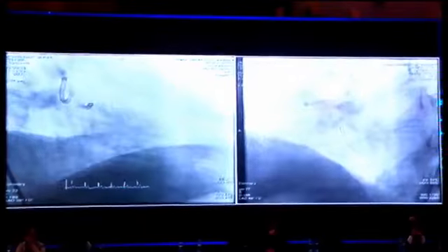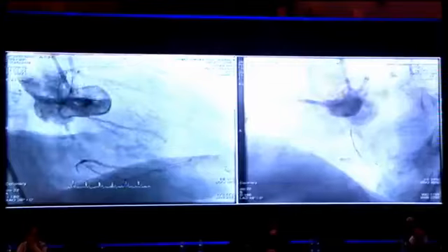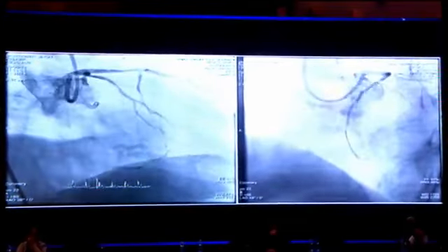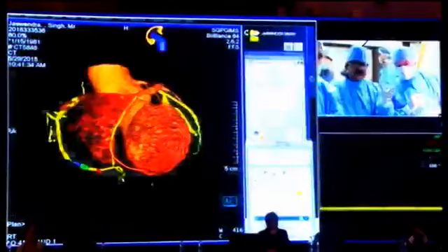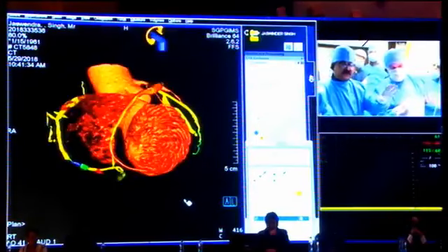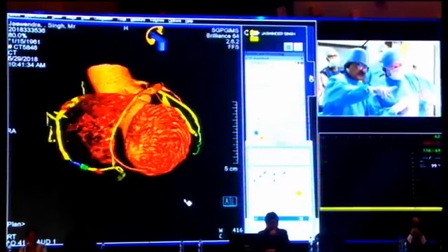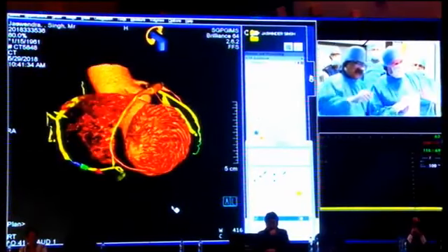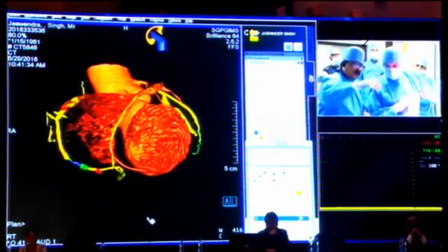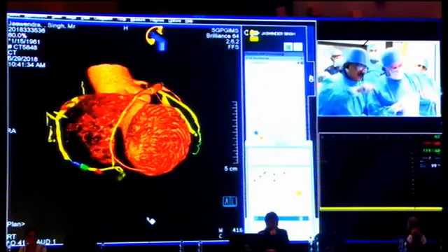Maybe we can discuss the CT because it's also important. So now to the other, you see what we have here, we also have CT on the side. Can you show the CT picture, please? And we trace the arteries on that, and you see the right coronary is seen in yellow color, that's the artery which is patent. And the ones which are green and purple have been traced by hand, trying to connect the two segments so that we have an anatomical understanding of the entire arterial tree where we are crossing the CTO segment.